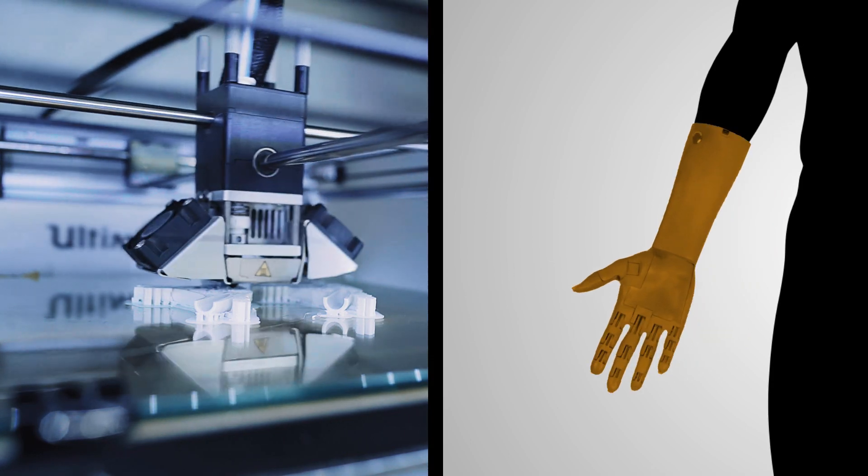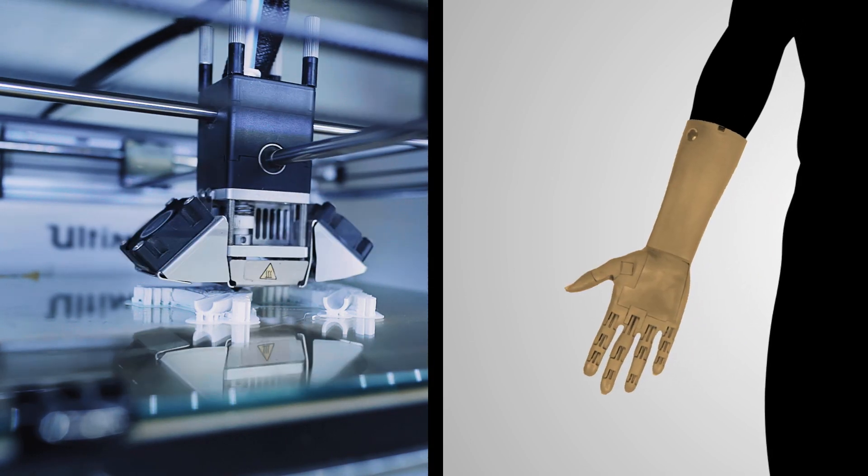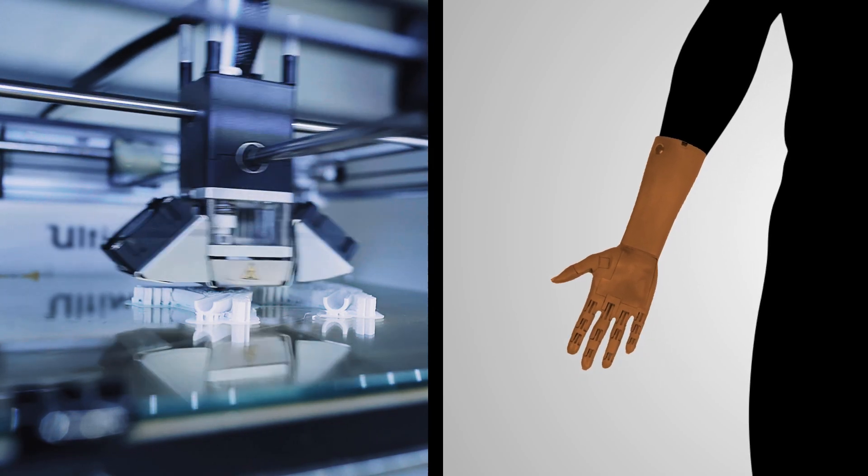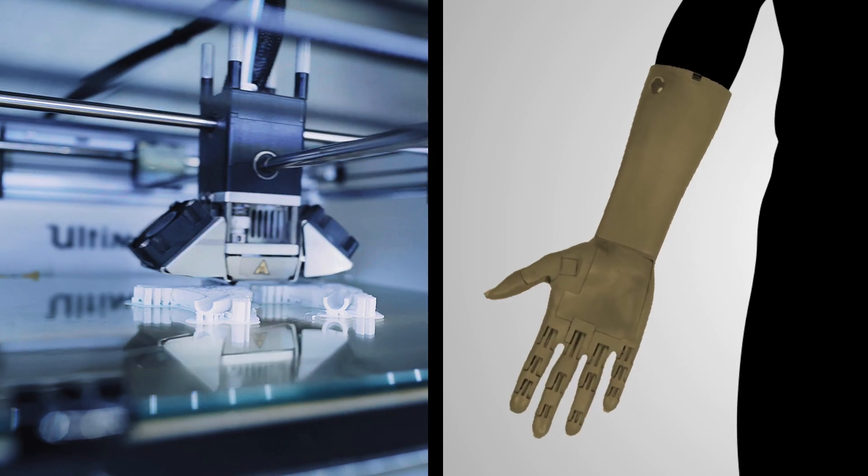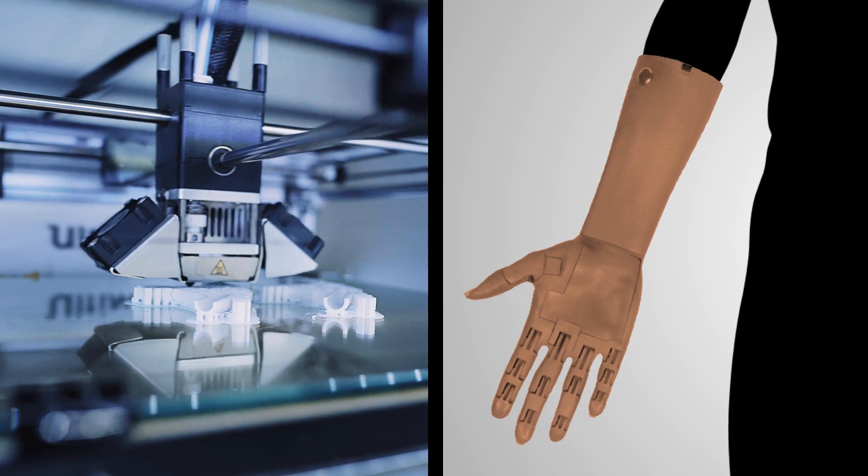After receiving the initial data, the company prints on a 3D printer and sends several test prosthetic products to the patient for fitting. This stage is repeated until the client selects the perfect arm for themselves.